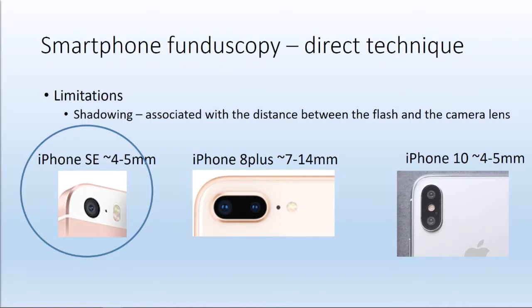And they measured the lumens, the objective measurement of the flash, and determined it to be as safe, actually safer by, I think, maybe 10 or 100-fold than the slit lamp or indirect ophthalmoscopy that we traditionally do for our exams. You just don't, like any bright light, you just don't want to leave it on the retina for any extended length of time.